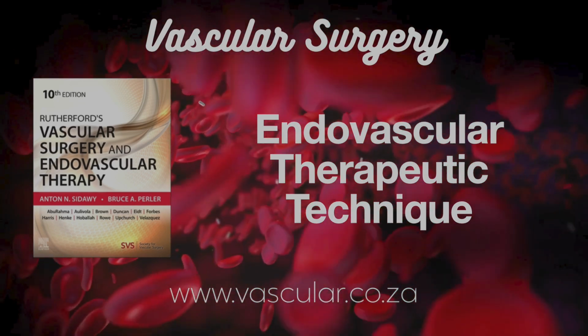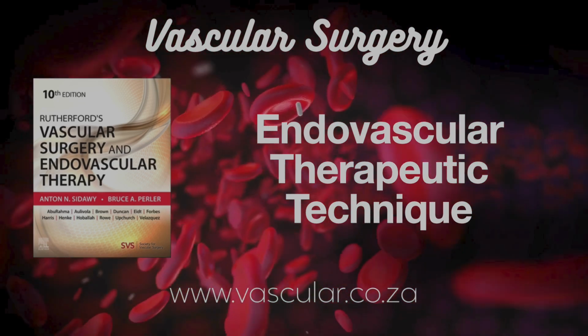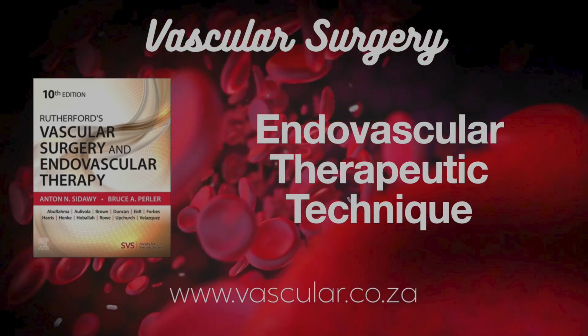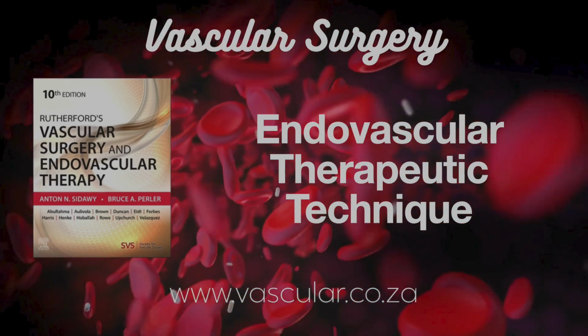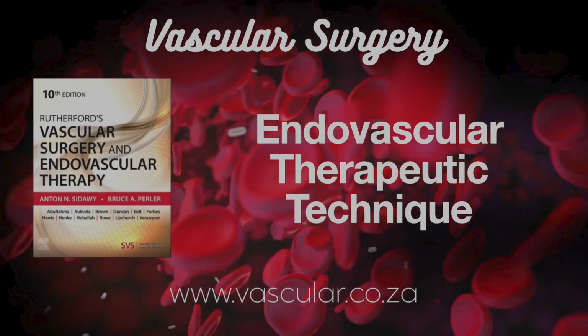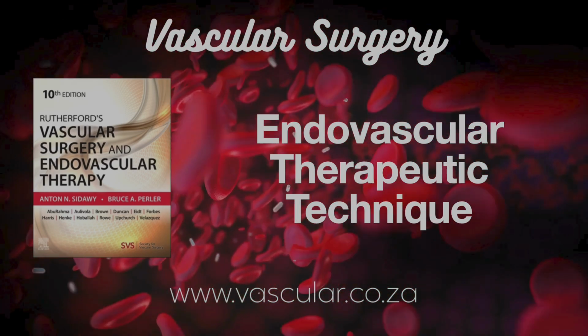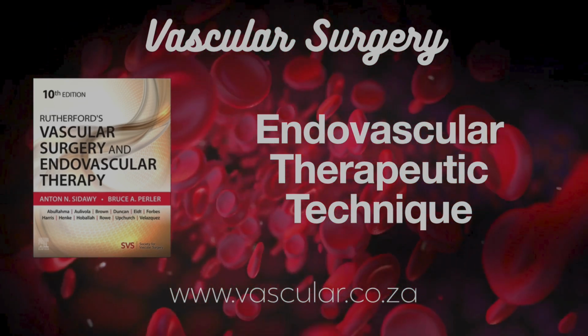Fascinating. Lastly, on stents. Bioabsorbable stents, BVS, the disappearing stent idea is appealing. How's that going in peripheral arteries? The concept of a scaffold that supports the vessel and dissolves over 2-3 years is incredibly attractive. Theoretical benefits are huge. Restore natural vessel movement, no permanent implant left behind, easier future interventions or bypass. Started in coronary arteries. Mostly, yeah. Early ones made of things like polylactic acid.